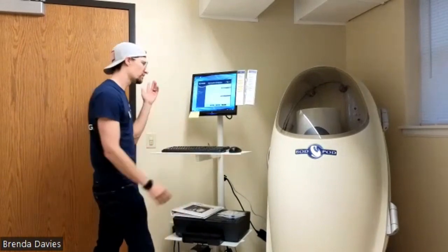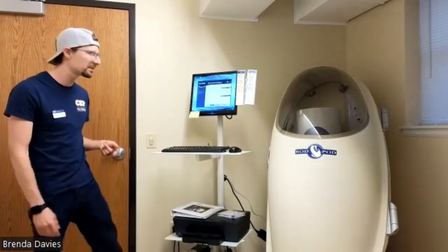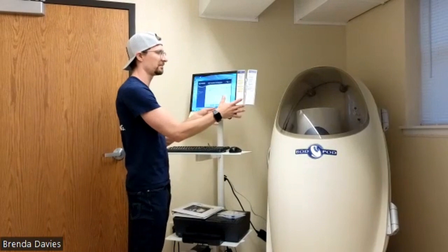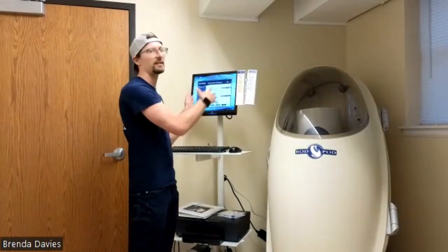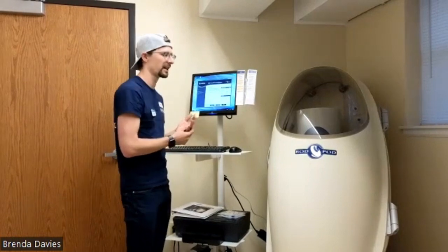So closing the Bod Pod door, click next, and it's going to work through that assessment for the cylinder. And again, the comparison between nothing and a known volume is going to make sure that this is fully calibrated.